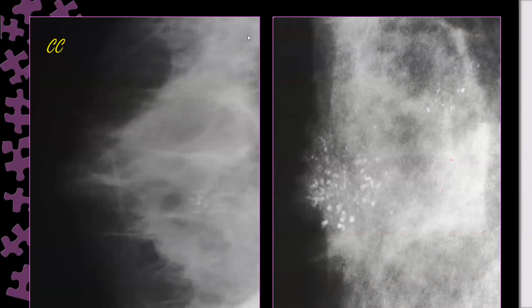The distribution of the calcification. If there is underlying mass or no? In this case, not theory. We are taking case discussion, and to see the importance of each additional view.